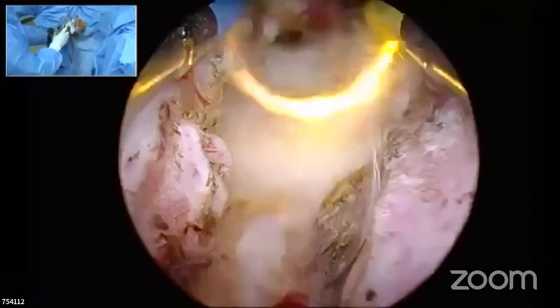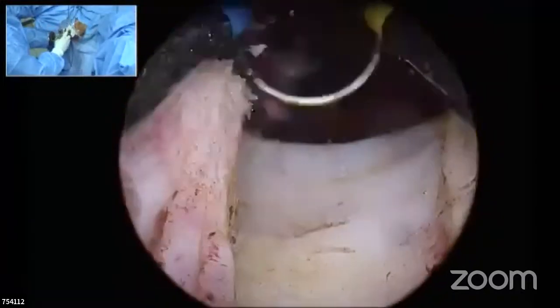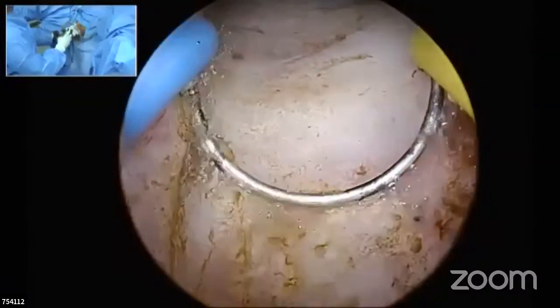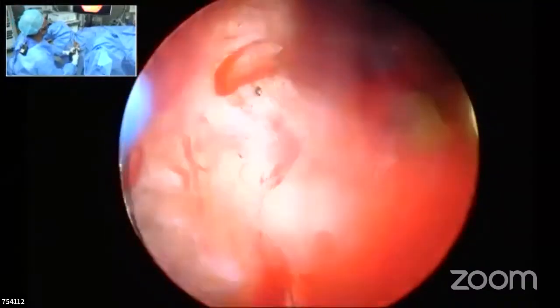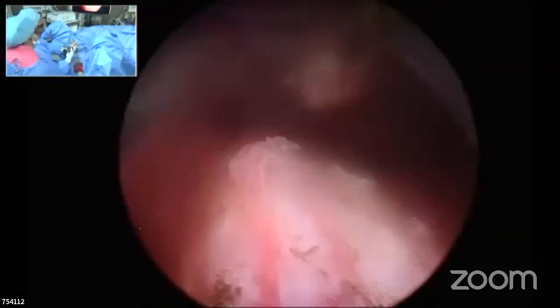So increasing the groove and deepening the groove will show up the bladder neck. People have a tendency to make this flat by resecting it. I would say resist that. I don't think resecting the bladder neck is of any use, absolutely any use. They have a tendency to keep it flat, but it is absolutely not needed to keep the bladder neck, bladder area or the floor of the prostatic fossa flat. So I don't do that.